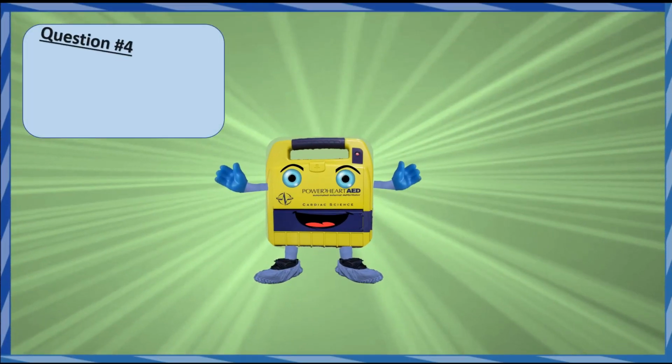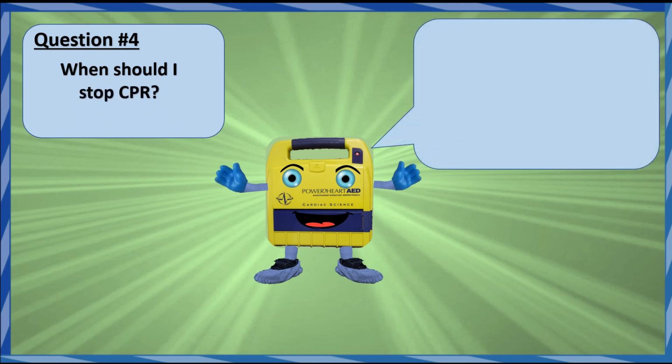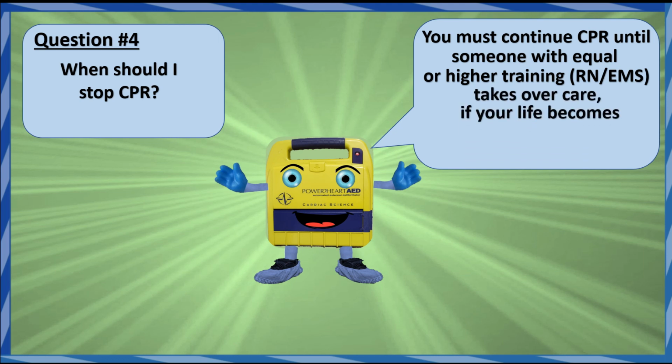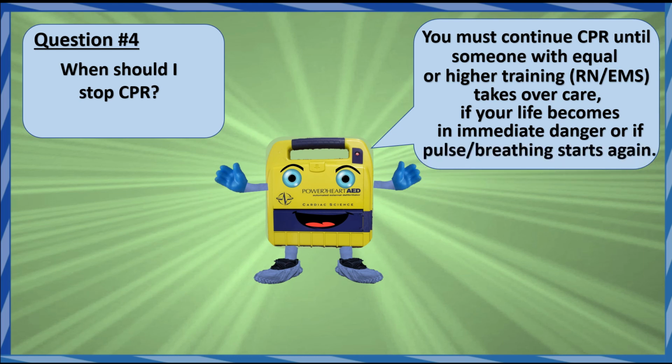Question number 4. When should I stop CPR? You must continue CPR until someone with equal or higher training, RN or EMS, takes over care, if your life becomes in immediate danger, or if pulse and breathing starts again.